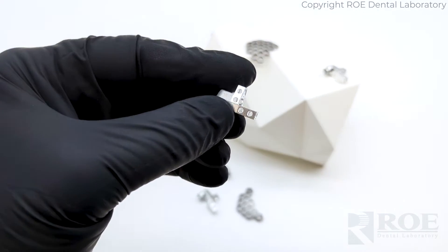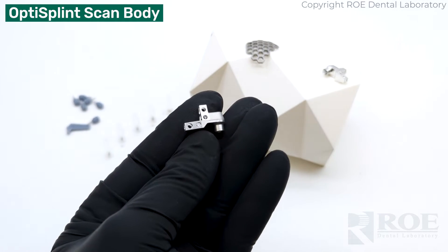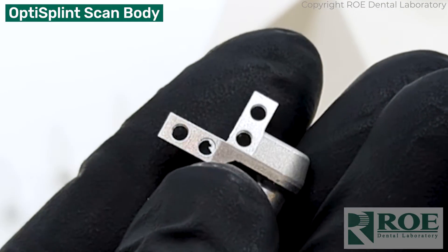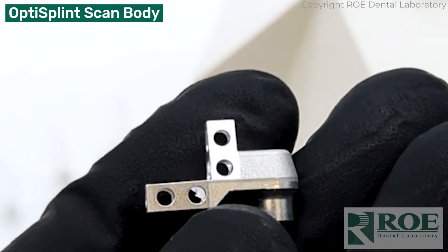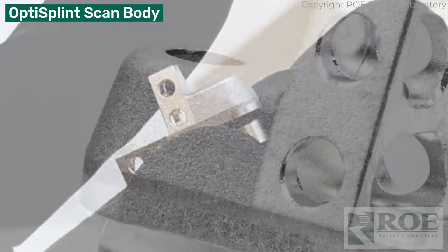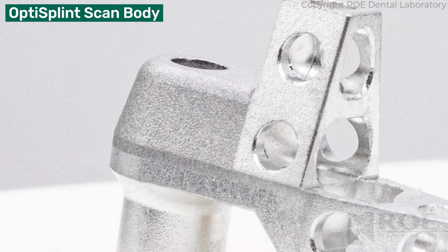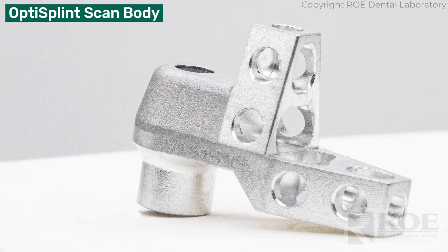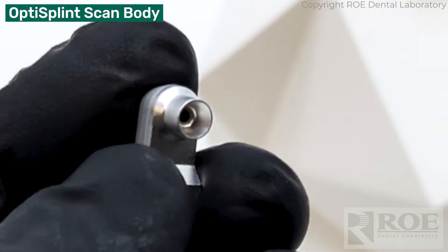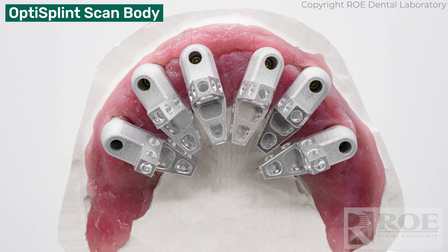The first item is the main part, which is the scan body — the OptiSplint scan body. It has a few different components: a vertical wing, the part that goes up with the rectangle area and holes; a horizontal wing, the part that jets out to the left; a scan body component which is a rounded part used for registration; and then underneath, the connection area.